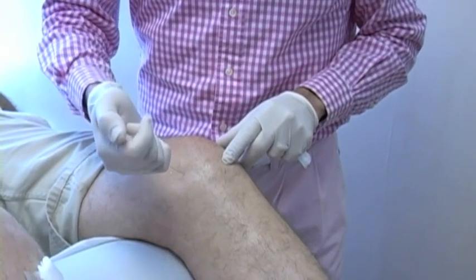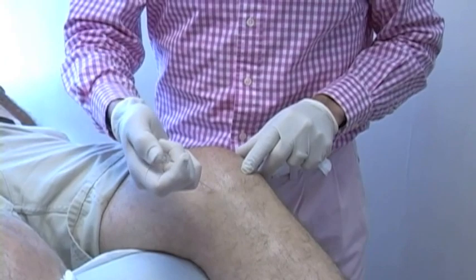Here we're doing prolotherapy along the left knee.